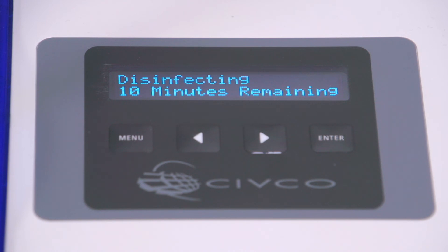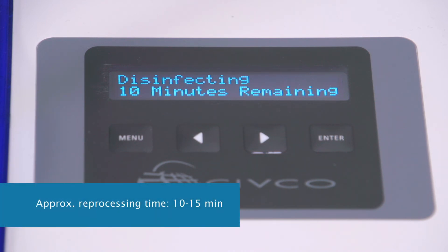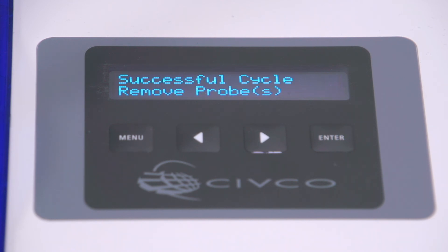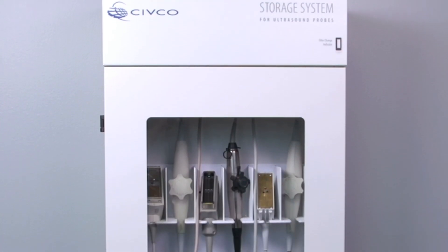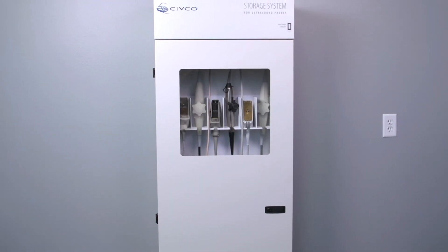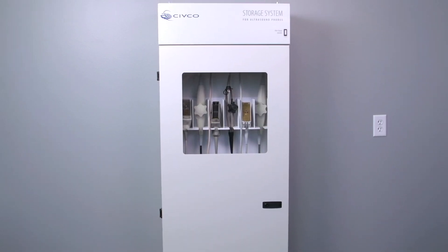Once reprocessing begins, the Astra display will show the estimated time remaining. Typical total reprocessing time including rinsing is only 10 to 15 minutes depending on the disinfectant used. At the end of the cycle, the display reads 'Successful Cycle — Remove Probes.' You don't have to remove the probes right away, but you should store your disinfected probes in a CIVCO storage cabinet with a HEPA filter.